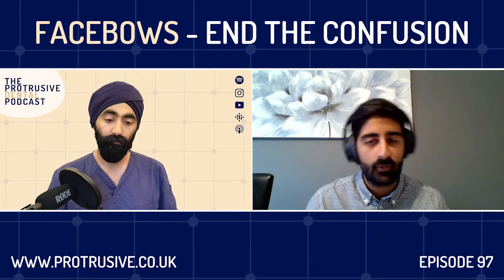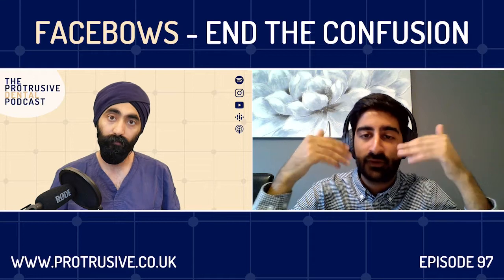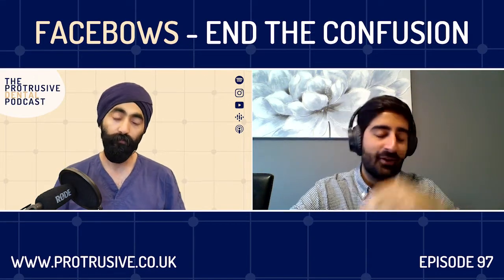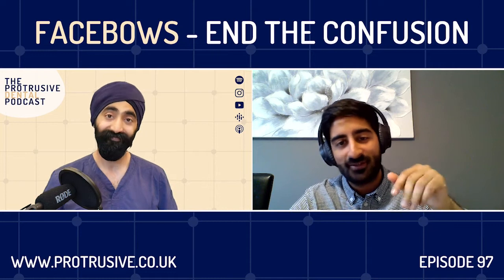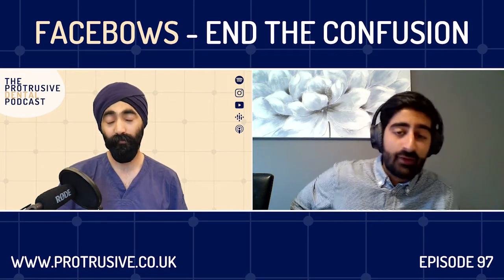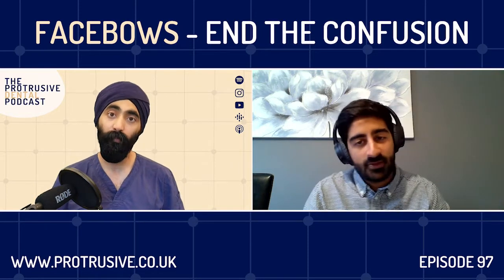Some people might be asking, why do you just mount them? So even the maxillary occlusal plane, we know it's not straight, right? It follows that curve of Spee, there's a slight downward tilt. So even all these little things, when you've got articulating plaster, if you've used it, it sets like this. When you're holding that model, you'll be moving it and it'll just set, and you're stuck in that position. So it's not an easy job that technicians have, and everything that we can give them makes it so much easier. Then we go into the semi-adjustable articulators.